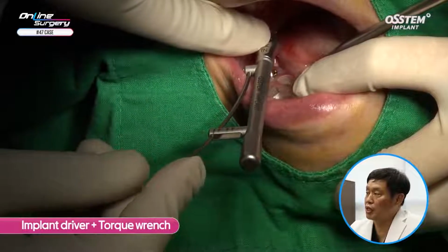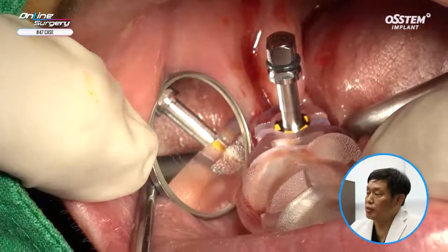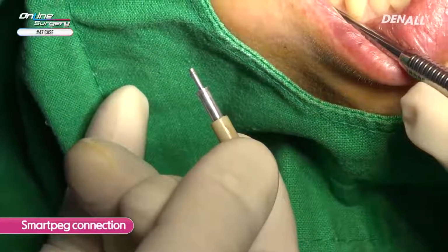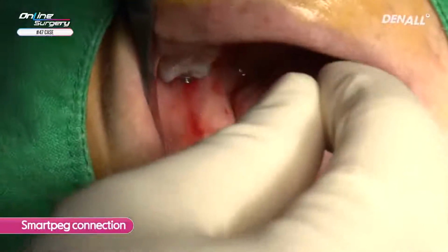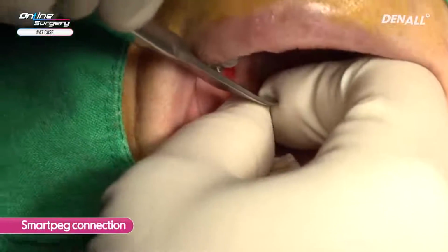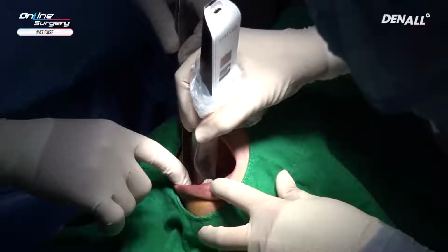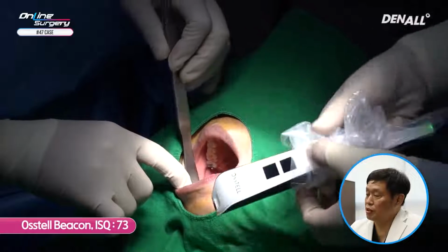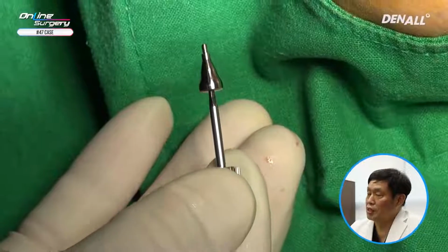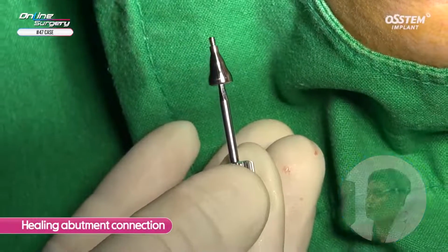The primary stability is good. It is over 30 Newton. This is the posterior area. I'm using a mirror to check the position and depth. The ISQ value is approximately 73. Primary stability is sufficient. The healing abutment is connected, and surgery is now complete.